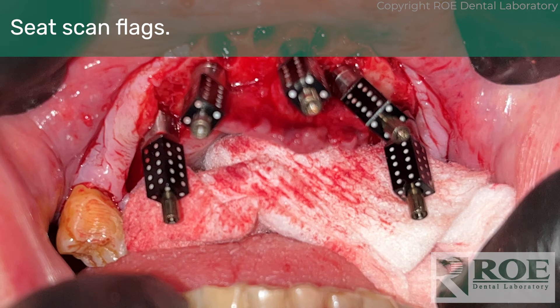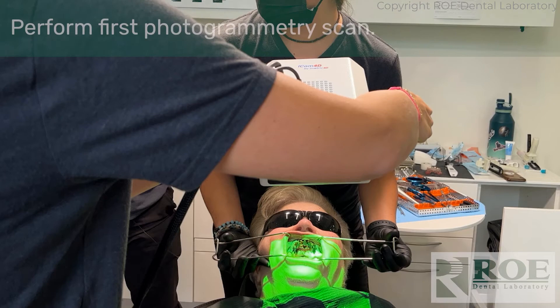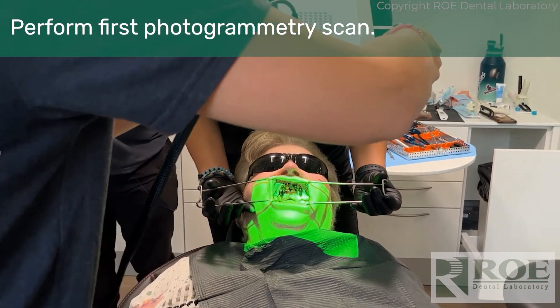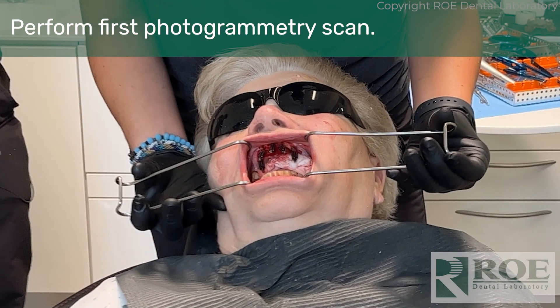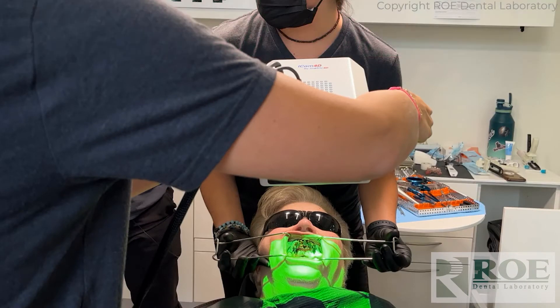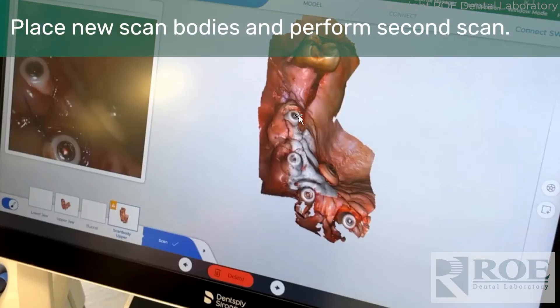For the photogrammetry scanning, this particular system is ICAM. The scan flags go in and the doctor scans for almost 100% accuracy — it's within microns of perfection. That's the first scan. The second scan will be of the scan bodies after the patient is sutured. Once the patient is sutured, the little scan bodies go in. There are different brands available; I recommend using the ones from ICAM or PIC, whichever comes with the system. Some are taller and some are easier for suturing.